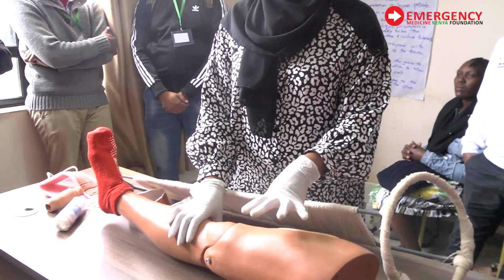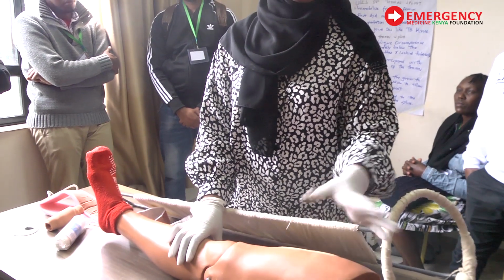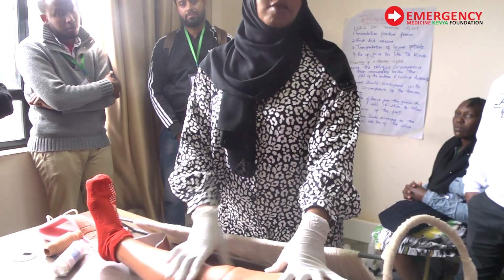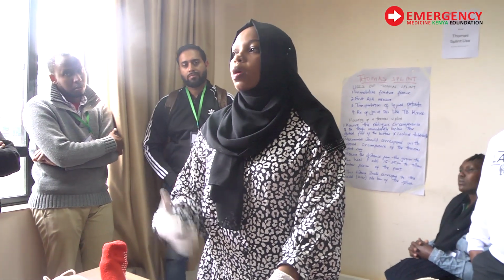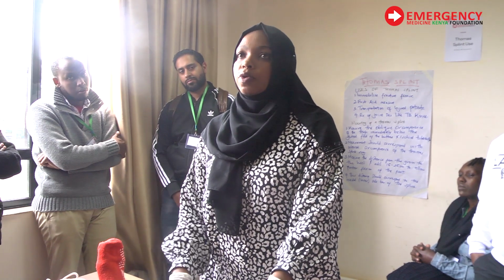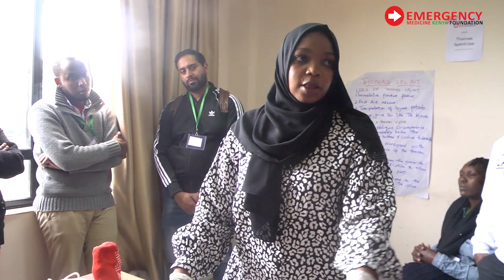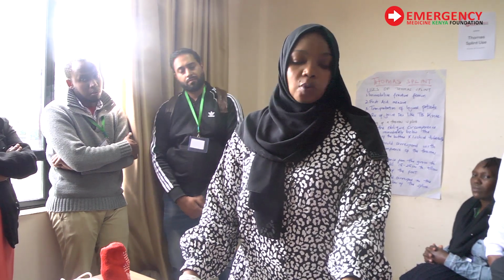Okay, I know we're very brutal when we don't have these things, you just tell him, you know, it's going to help you for a few minutes, you'll feel pain and we proceed. But if you have capacity and you have the rights of doing this, proceed and do it, okay? It's very life-saving and it helps a lot, okay? So that's one thing. So make sure the patient is pain-free. I've done my block. So what next happens?